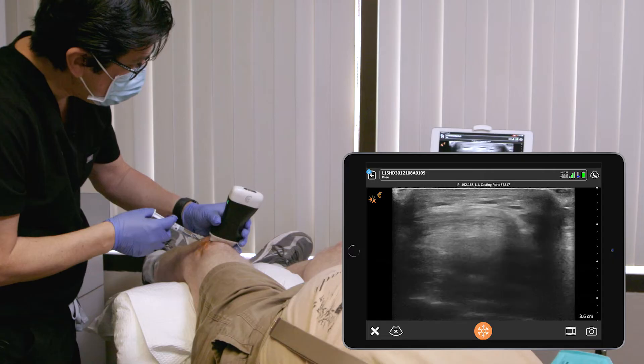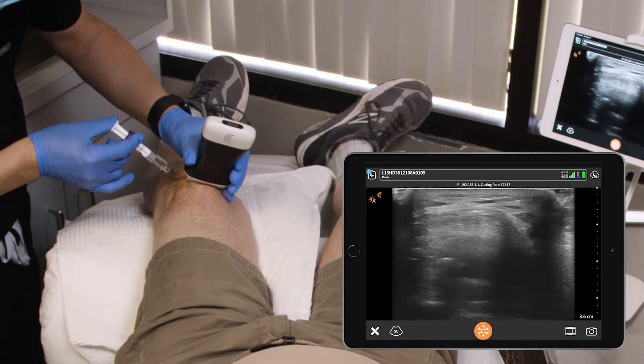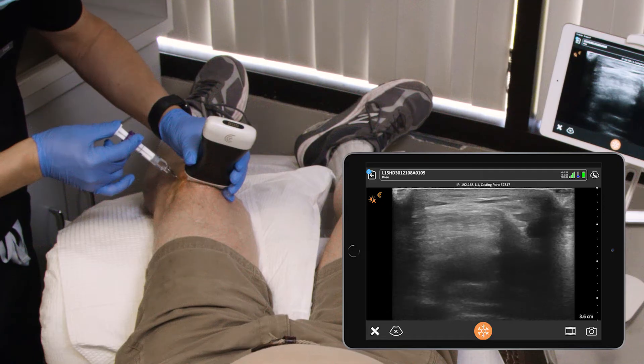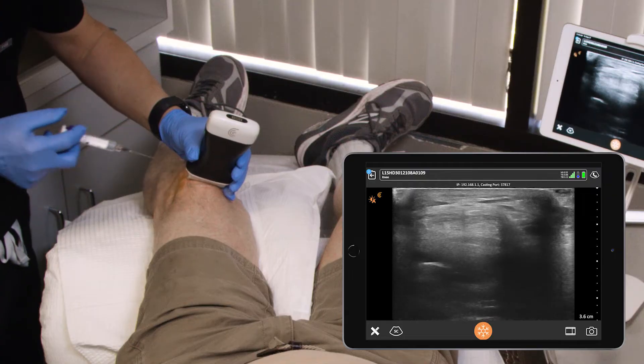There we go. We're good now. We're in the right spot. Yeah, we're in the right spot. We're good. That's it.